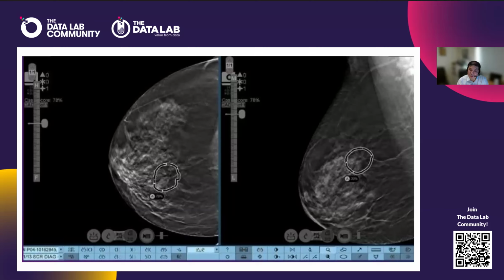And some people are using the 2D AI in the one-stop breast clinics as well, particularly Dr. Sharma in Leeds, where we're trying to see if we can triage women better in clinics. Say, actually, the AI, as soon as you're having a mammogram, is detecting a tumor, we might move you into a biopsy slot in the clinic rather than have you wait a long time for your clinic appointment.